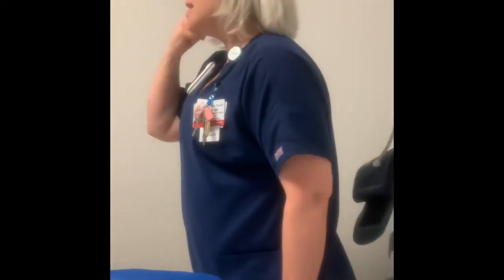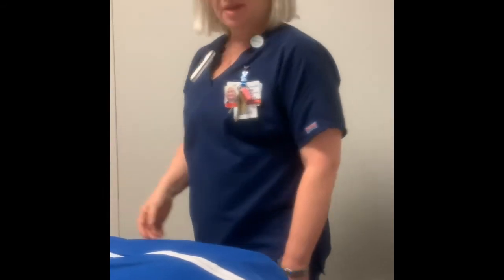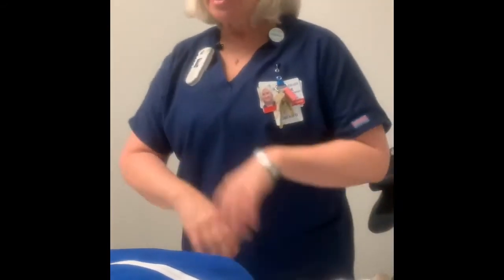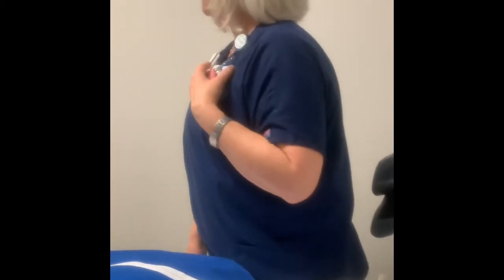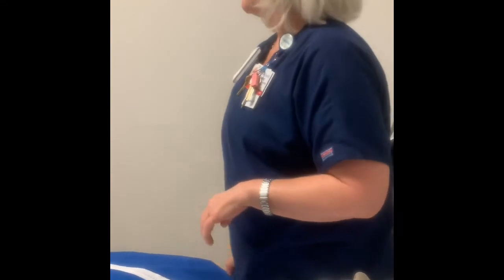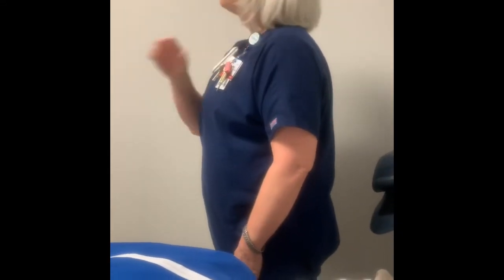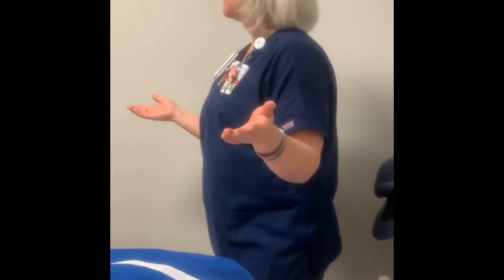But you'd be surprised how many people would do that. And it's been done a lot. So that's why we have this alternate airway initiative at Banner, because of that. It's just not here, it's nationwide. If you're walking up on a patient that you don't know, you don't always know which. So it's just best to ventilate the stoma if you have no clue, but here in the hospital, you should know.